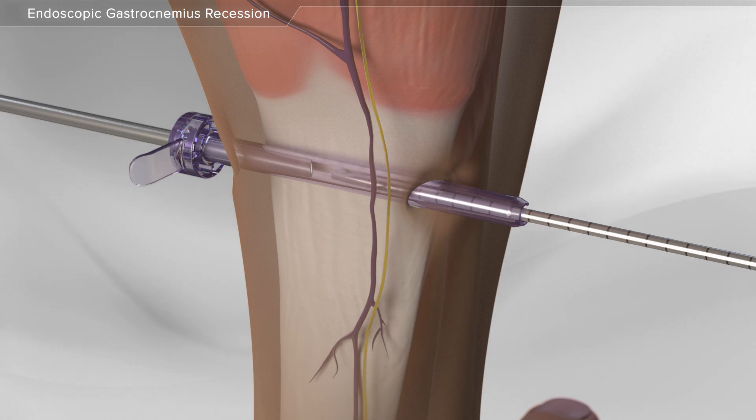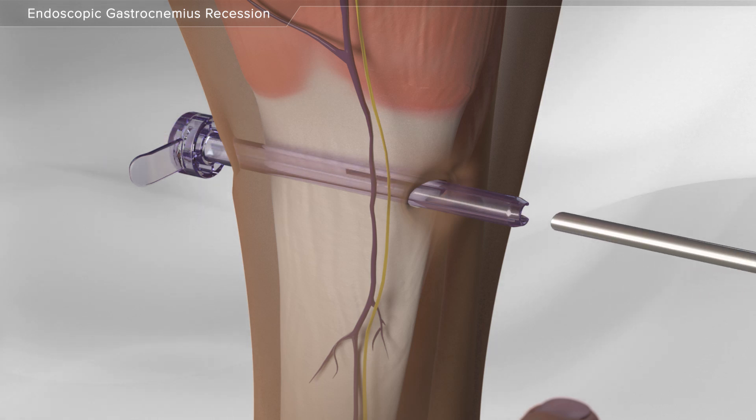First, one half of the muscle is released, followed by the remaining muscle.